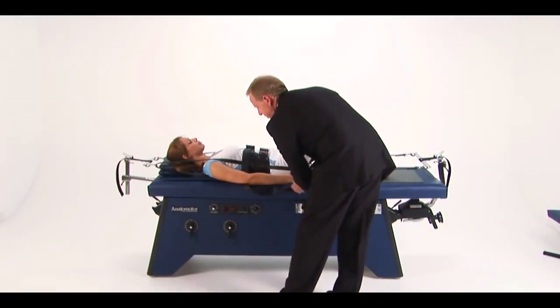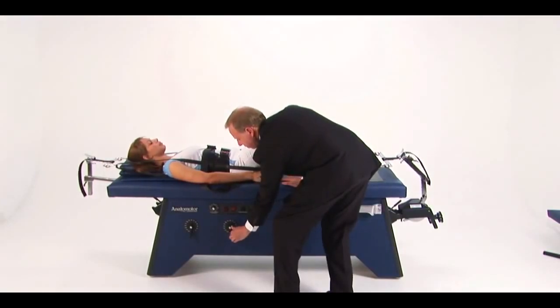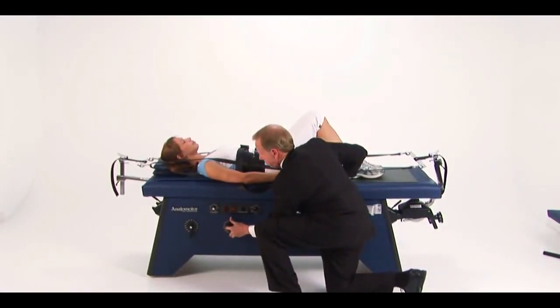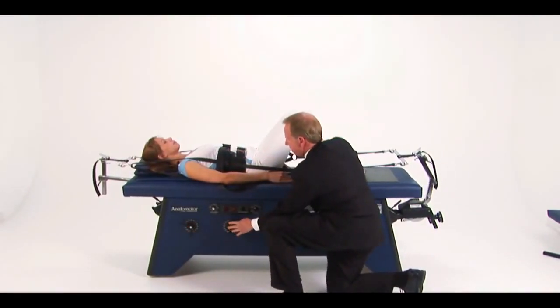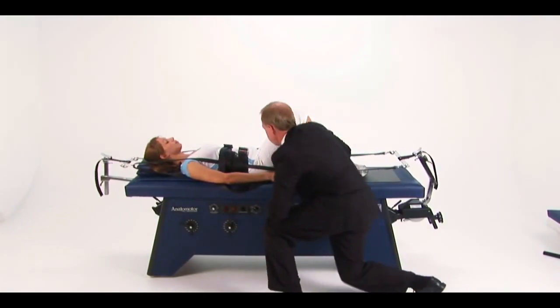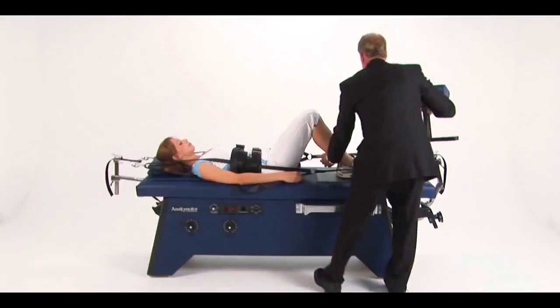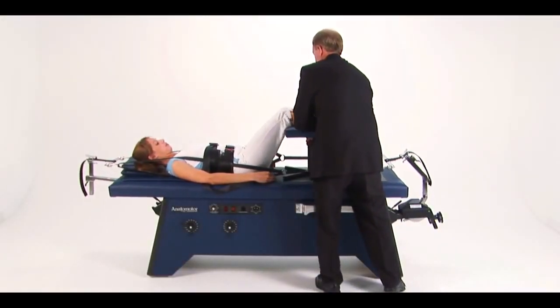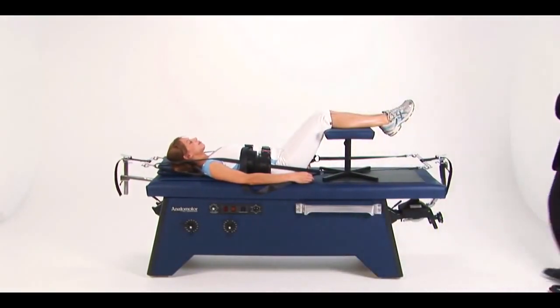To start the table in motion, set the timer for 7 to 10 minutes. Properly position the back rollers so that they rock the sacrum, creating pelvic tilt. This tends to flatten or flex the lumbar area at the peak of distraction. Lumbar traction should be gradually increased in increments of 10 to 25 pounds. Using an adjustable flexion stool will help flatten or normalize the lumbar curve and often makes the patient more comfortable.